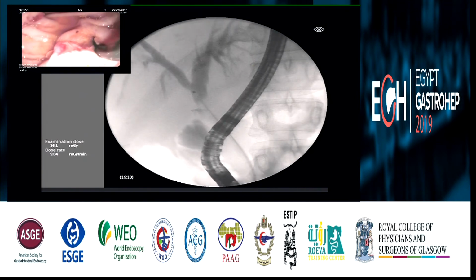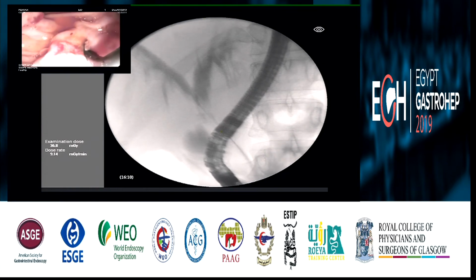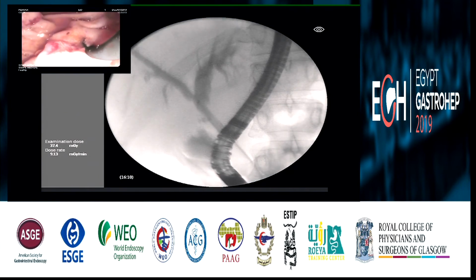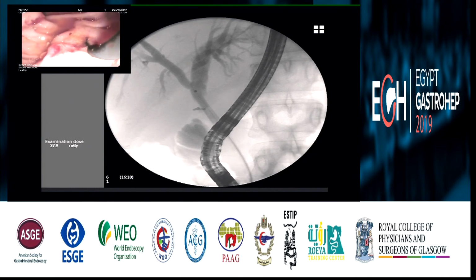Yes, please inject. So now the balloon is inflating. Very slowly. One turn. Okay, stop. Give it time. So you keep it for 1 minute, 2 minutes, 30 seconds, or it doesn't really matter? It really doesn't matter. We do it for 1 minute, just because when you're not measuring time, it looks like forever.